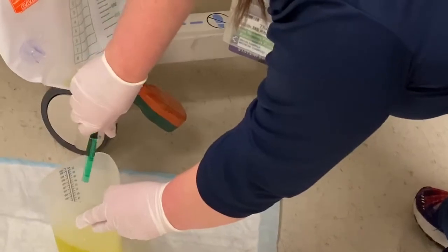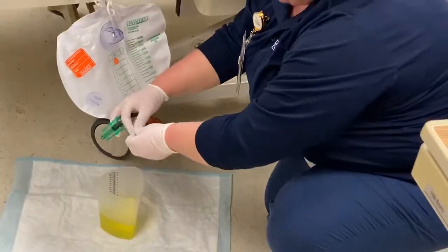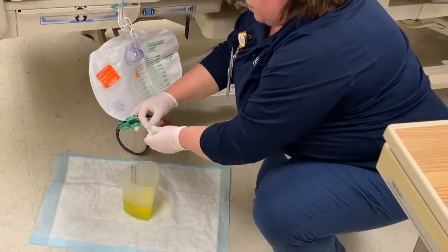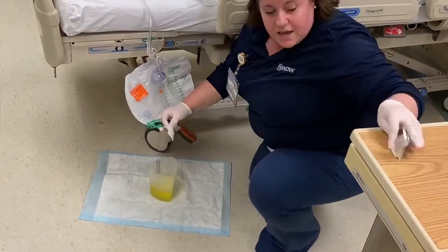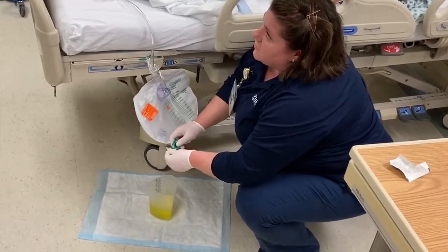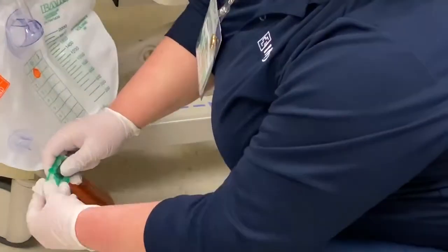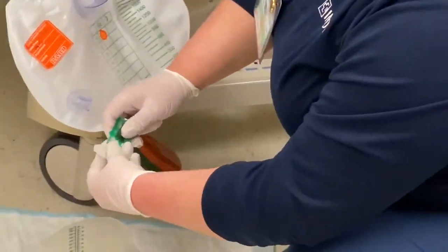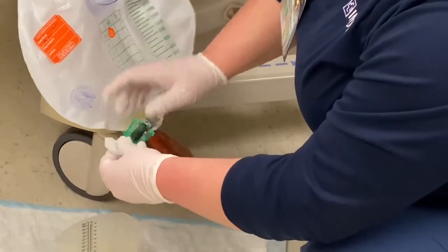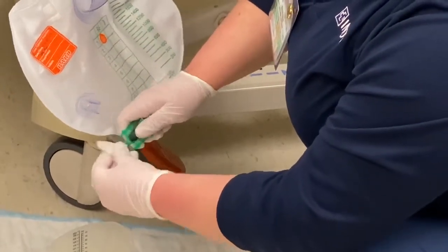Okay, once that's all drained out, I'm gonna clip my silver clip back in place, and now I need to clean my spout. So I'm going to take my alcohol wipe, and looking at the clock so my timing is accurate, I'm going to clean this spout for 15 seconds. The reason I'm doing this is if any bacteria did get on the spout, I don't want it to be able to crawl into my urine bag, because then it can crawl up the tube into the bladder and cause a urinary tract infection.